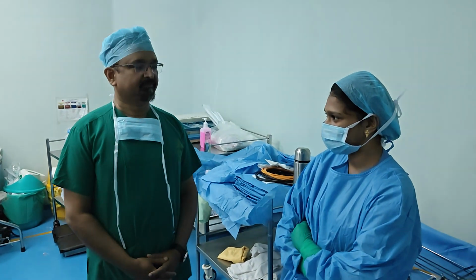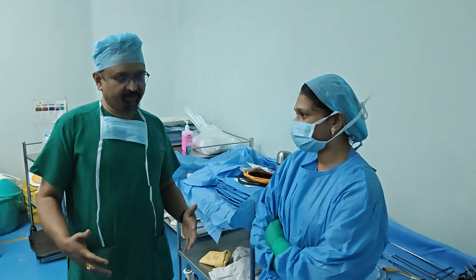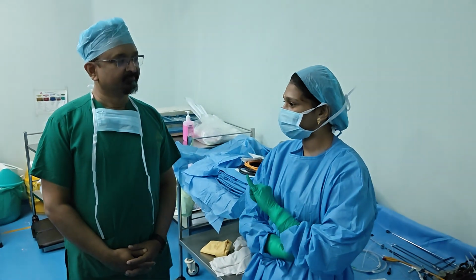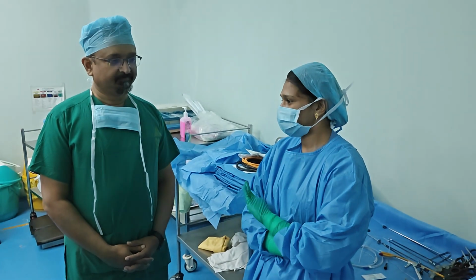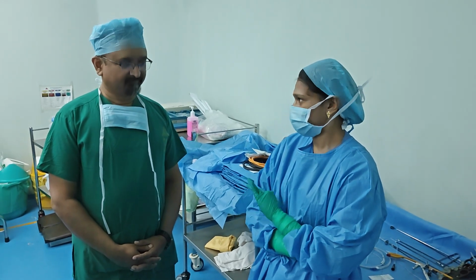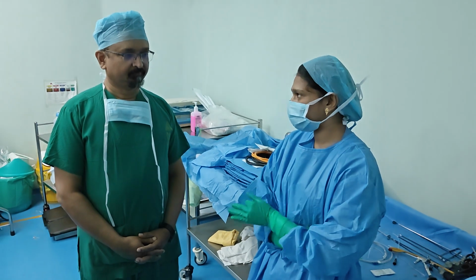What do you want to know about the patient, about the condition? What are the preparations you do as a scrub nurse? As a scrub nurse, we have to know the age of the patient, the weight of the patient. Then the instruments required for whatever case you have posted, whether it is pyeloplasty or hypospadias. Depending upon the case, we have to prepare the instruments.